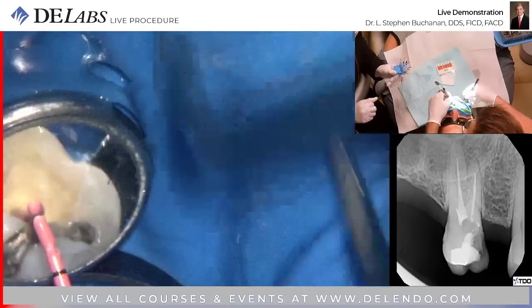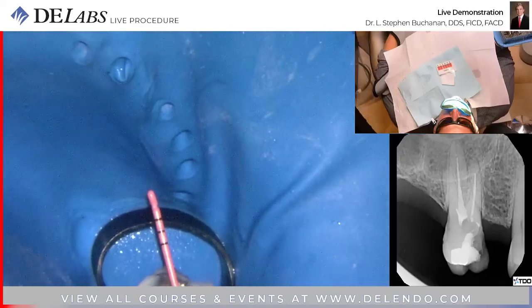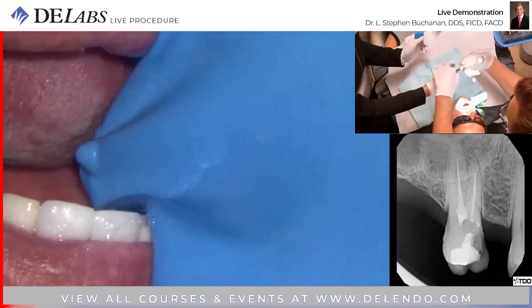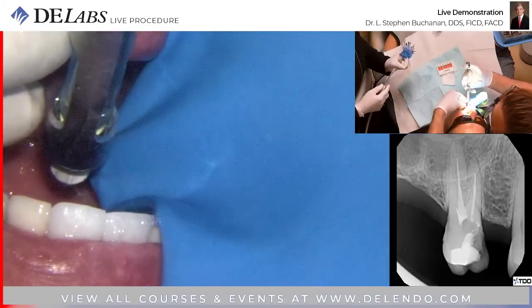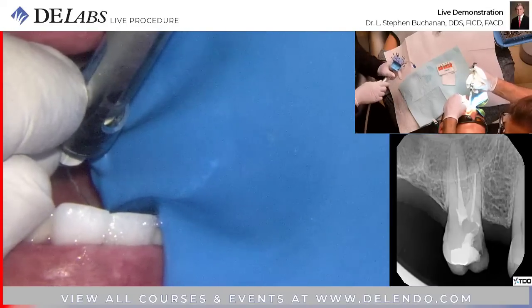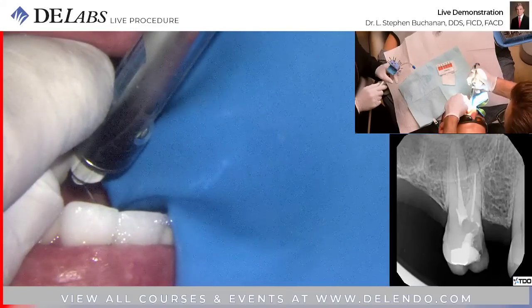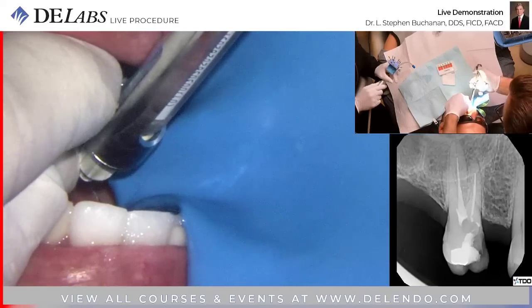Did you feel that? Okay, let's give you some more anesthetic. Turn to the right. Okay, so anesthesia for a maxillary molar is half carpule as palatal infiltration and 1.5 carpules as buccal infiltration. That'll carry you through a lot of single visit procedures. This one we had him numb probably half an hour before we got to start. So I would say when I have a tough case, I am going to have to reinforce right before obturation.